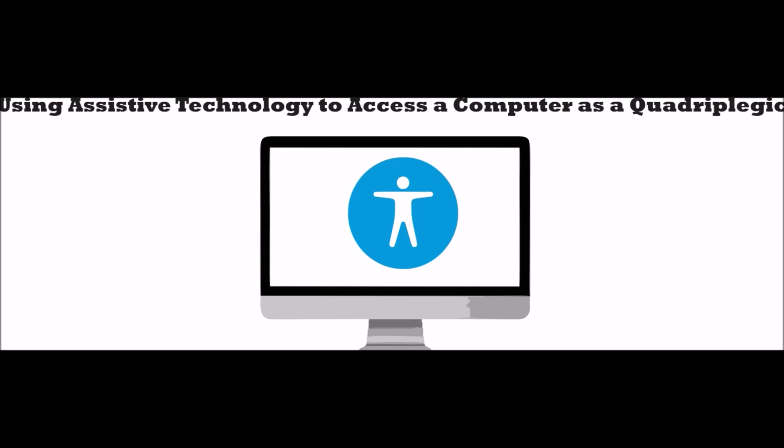The final piece of software that I use is a program called Natural Reader. This is a text-to-speech program that allows me to read PDFs and websites just by opening the file location or pasting the website link into the program. I can also save the audio as an MP3, so if I want to, I can listen to my book on the go. The program also has a feature called Optical Character Recognition. This means I can take a picture from my phone of a piece of mail or something that I need to have read, and it will convert it into text, which will then be read by the software.